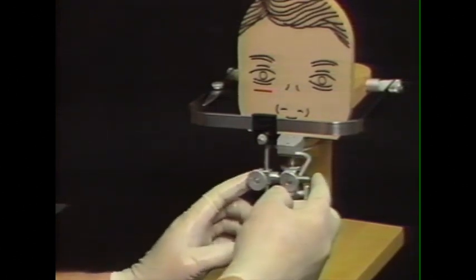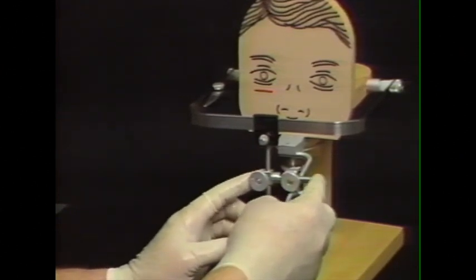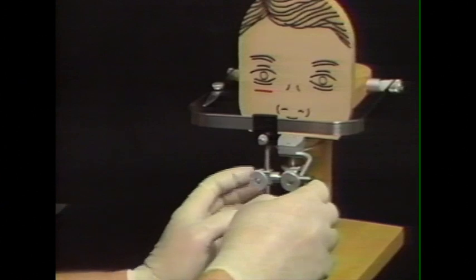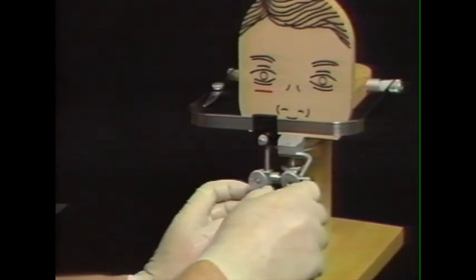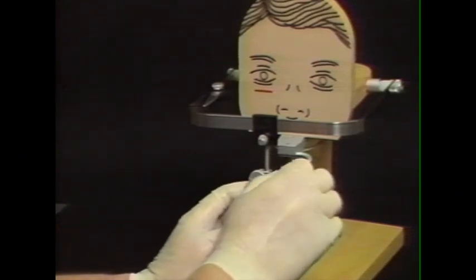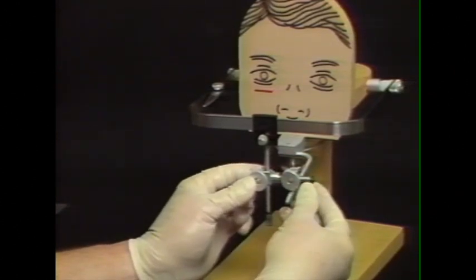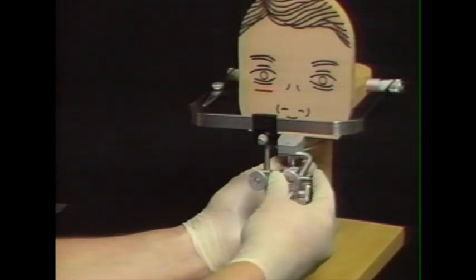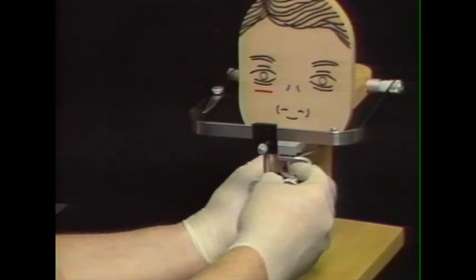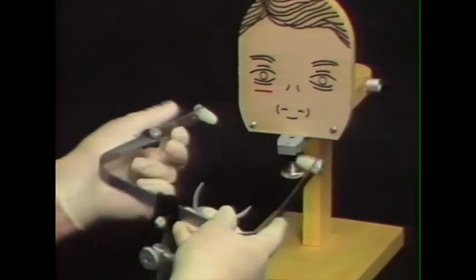We can now center the Facebow by moving it from side to side. This centers the Facebow laterally as well as anteroposteriorly. Once it seeks its level where it's not binding, we can then tighten nut number 2 and number 3. Now, all we have to do is have Harvey open his mouth here and release the bite fork, and we spread the ear rods and remove it from the mouth.